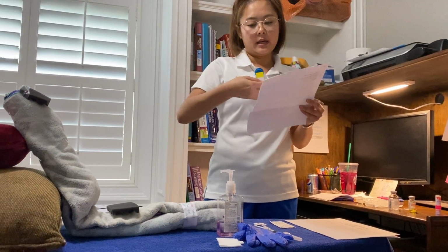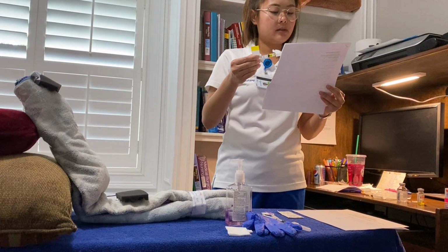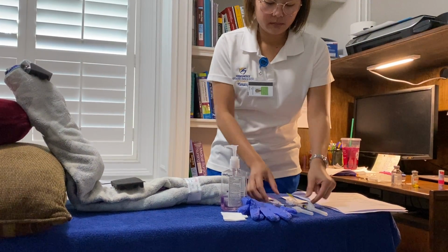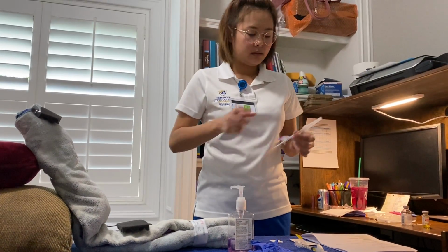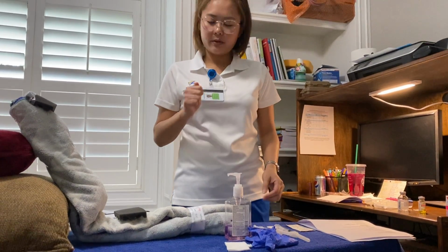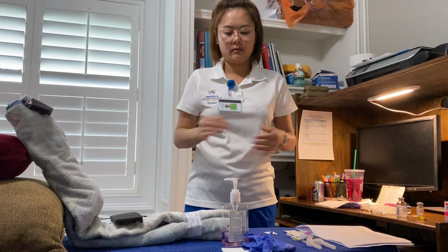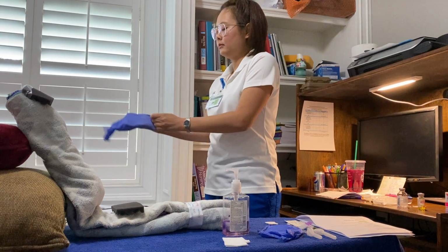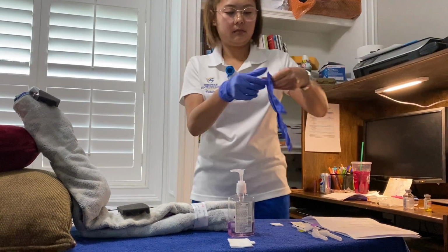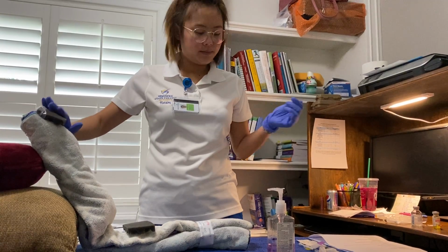And then I have Anna Hawaski, influenza 0.5 ml IM, and the purpose is to prevent the flu, and the time is now. Documentation needs to be done. All right. I'm going to scan the medication, scan the armband, scan the second medication, scan the armband. Okay, everything matches. Relax your arm for me.